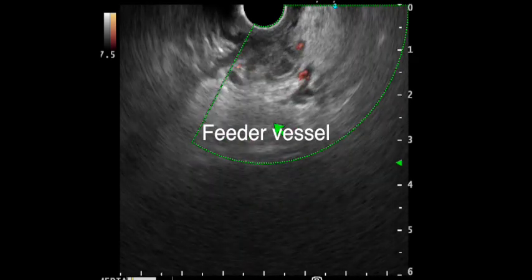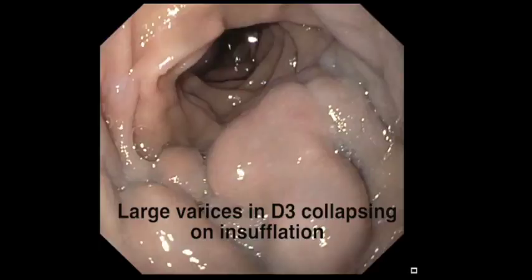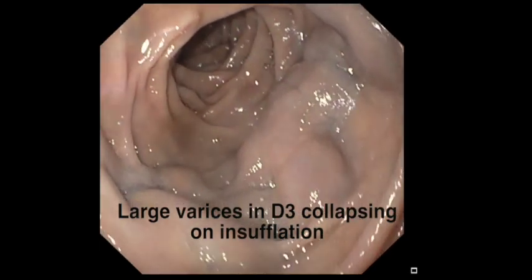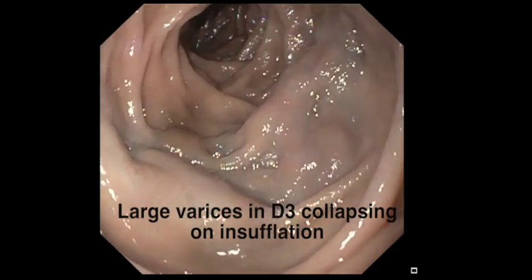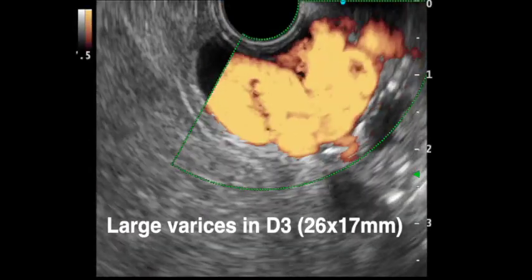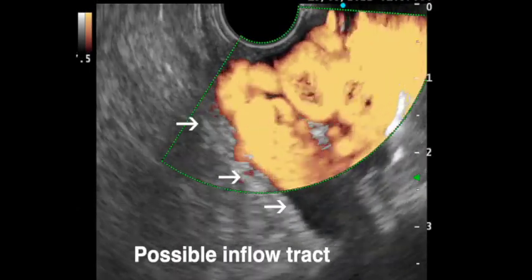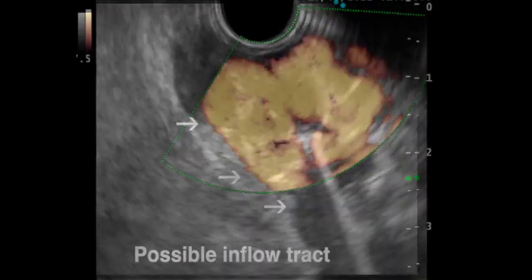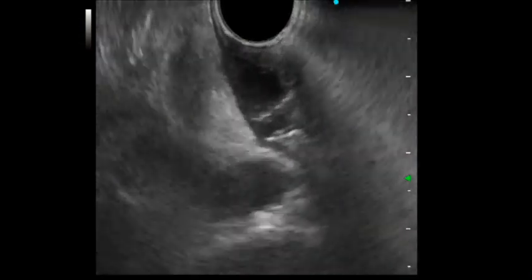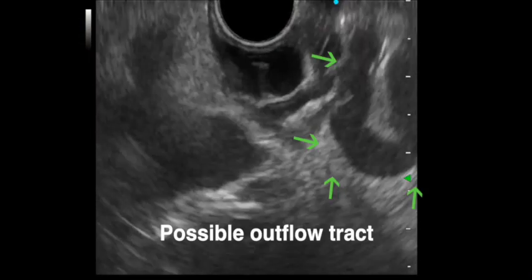EUS-guided embolization of ectopic duodenal varices. A gastroscopy showed large varices in duodenum part 3 which were collapsing on insufflation. EUS showed a large varix of size 26 by 17 mm with a strong Doppler flow. There were two extramural collaterals seen on both sides of the varix, and they were thought to be one inflow tract and one outflow tract.